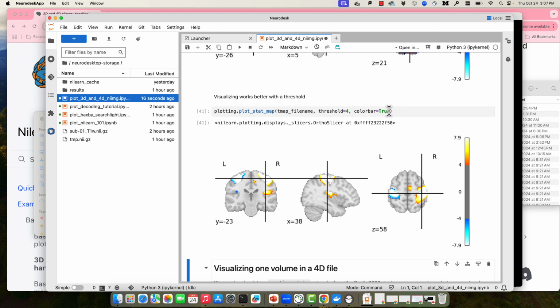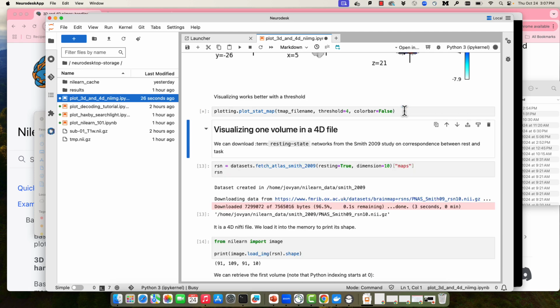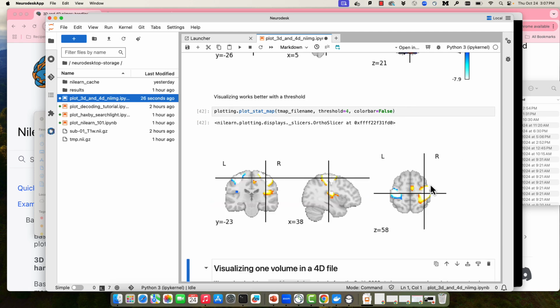Some other basic things just about how to display, how to use the plot commands. You'll also notice that there's a color bar option. You could change that to false. And now I'm simply displaying everything but with no color bar. Right? So again, it can get very detailed. We're working at a pretty basic level right now, but just notice these are pretty useful templates to have and modify. And usually I never start from scratch. I just use what's given here and then add things as needed and change them.